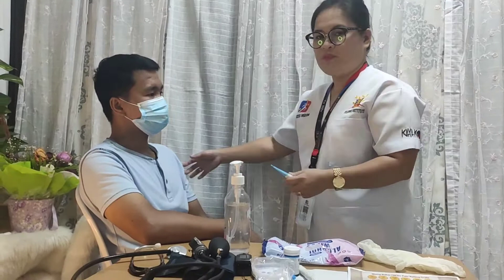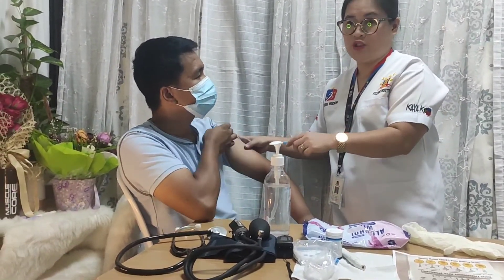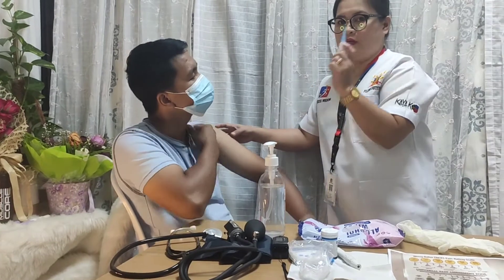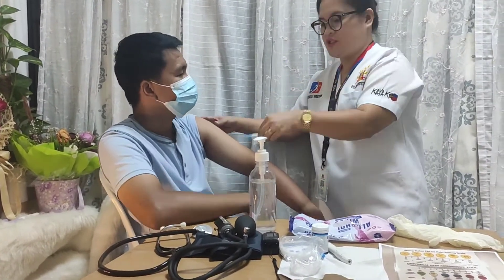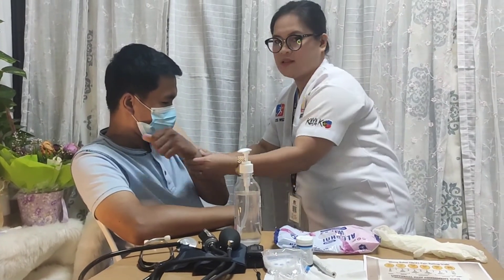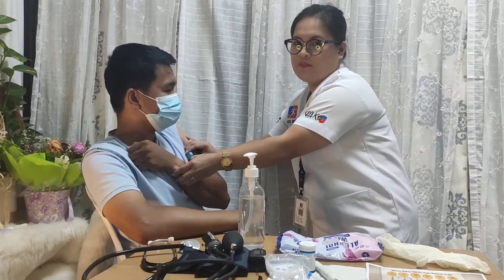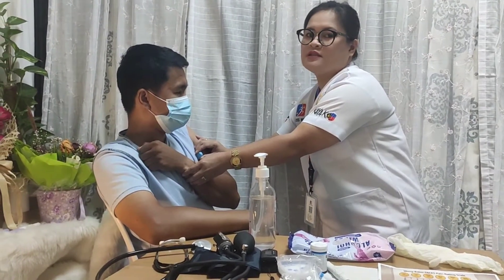Using the axillary thermometer: expose the patient's axilla. If it is wet, dry it with tissue or towel. Place the probe into the center of the axilla and place the patient's arm over the chest. Hold the probe, wait for the beep tone, and document the result.